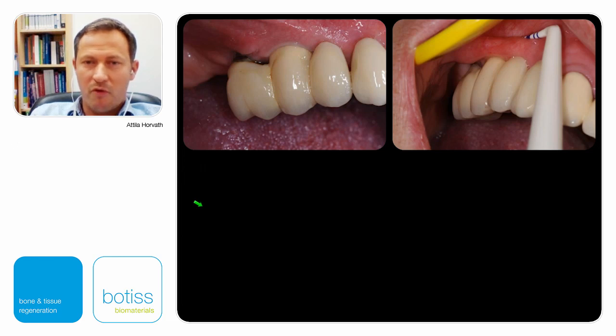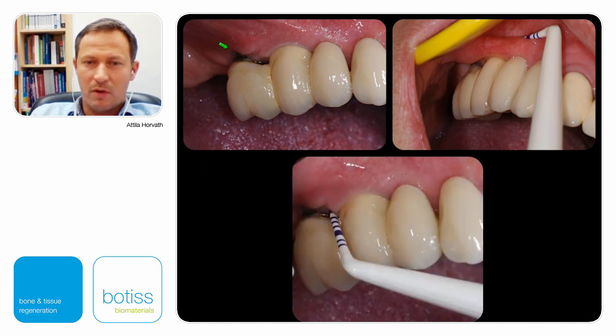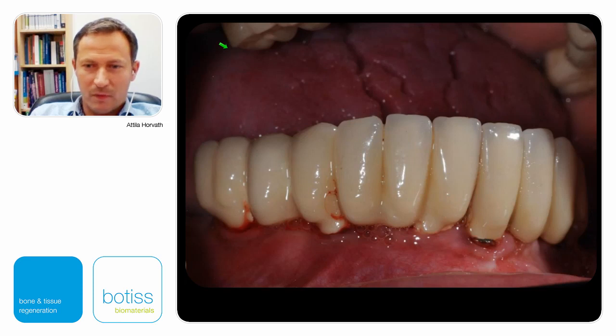Again, the upper right quadrant of another patient: nice, firm, attached mucosa here, and none there, without any vestibule. And of course, we can probe the pathological pocket around the implants. And the last case for the introduction, to make our evening more interesting, this lady. This lady was sent to our practice with some discomfort in the lower jawbone. Nice implants have been placed, not in an exactly correct position, but good quality implants. What we could see is that again, there is no keratinized mucosa and an extremely shallow vestibule.